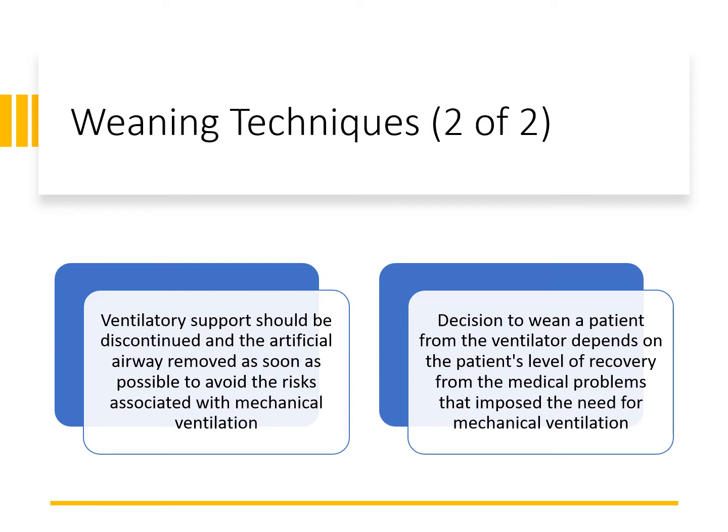Ventilator-associated pneumonia or ventilator-acquired conditions: if we leave them on, there's a higher chance for microaspiration and them developing a pneumonia that they may not have even come in with. So that's something to look at. What about trauma to their airway, right, from the endotracheal tube that sticks into their trachea? Even though it's made of materials that should help reduce the likelihood of trauma, is that something that could cause unnecessary damage to their airway, even if the cuff is at the right inflation level?